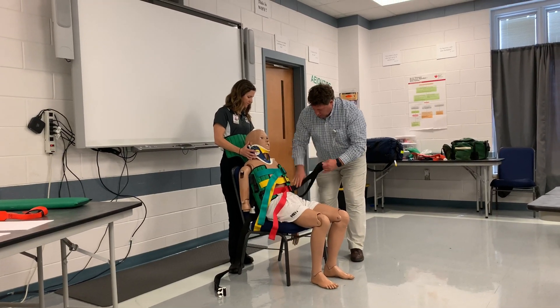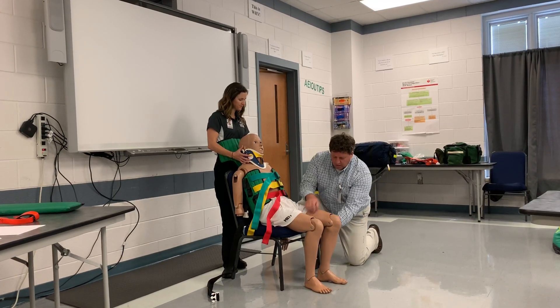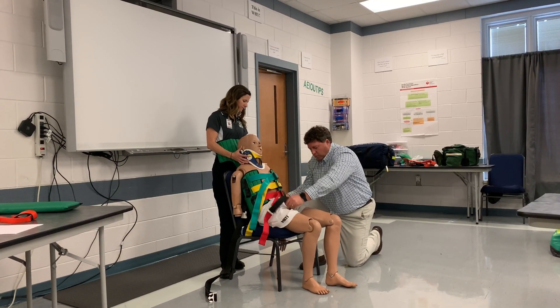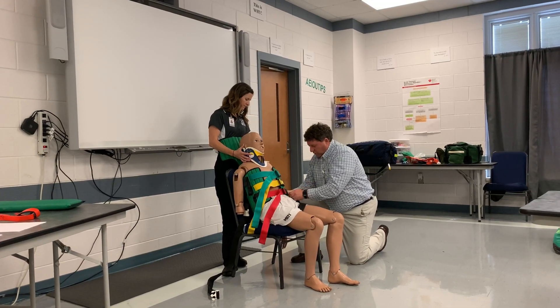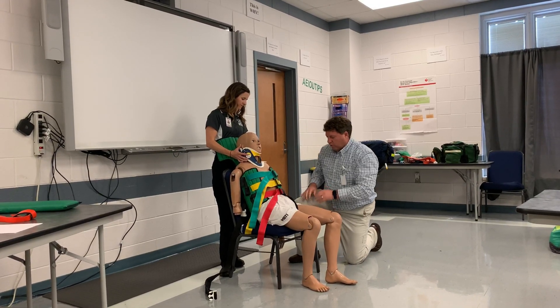Now I have these two leg straps, and these are going to go from the outside, around their leg, under their leg, and I want to get it up real tight into the groin. So I kind of seesaw it back and forth until I get it up fairly tight into the groin, and then the white buckle. Same idea here - I feed it and pull it so I don't hurt them.